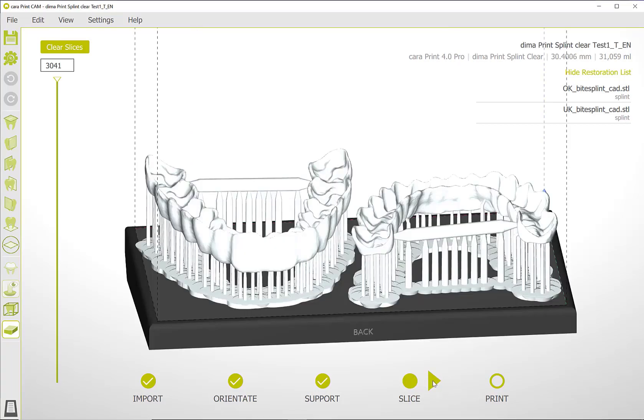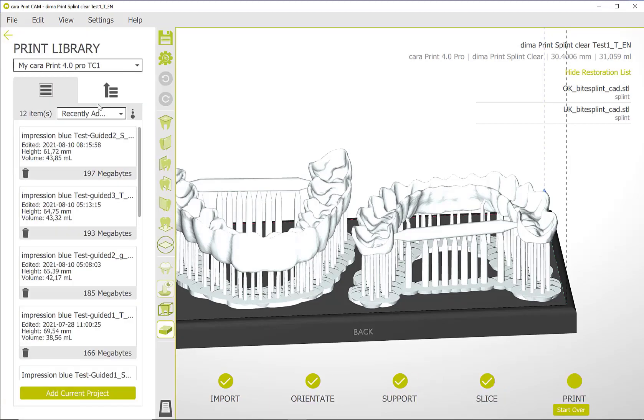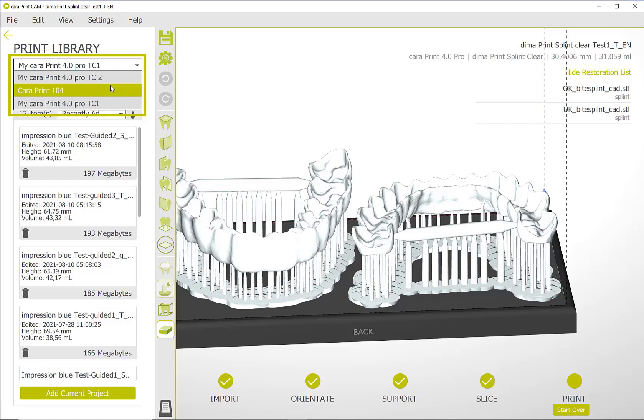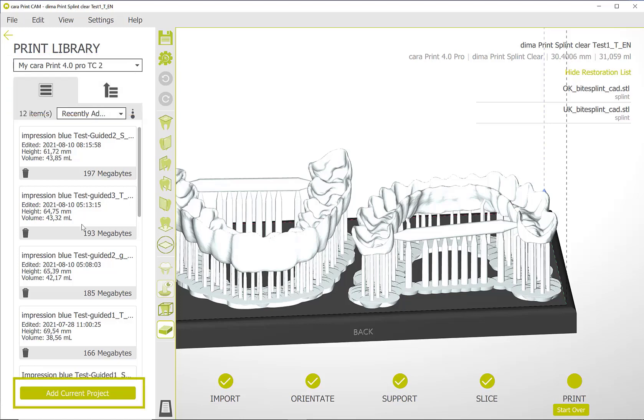To transfer from within the system, go to the print step. Here you will see the available printers on your network. In the drop-down menu, you will see all the printers connected in the network. Select the printer you want to use to print the project and start the transfer.